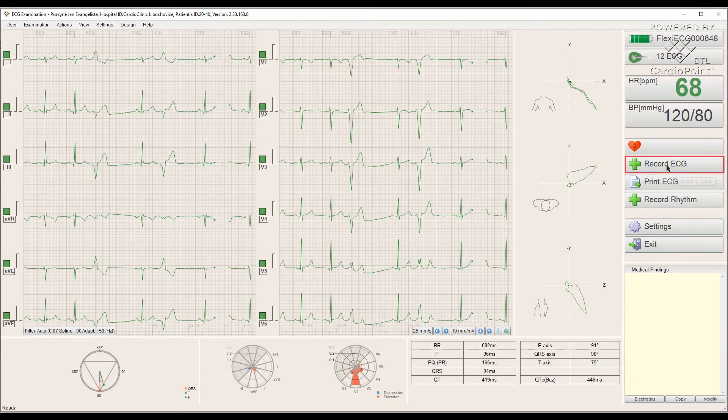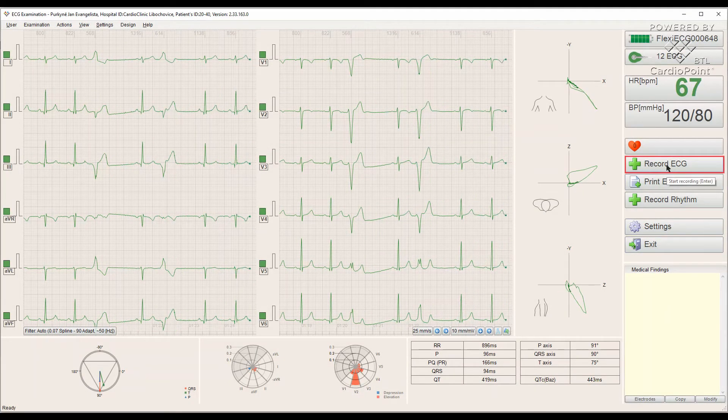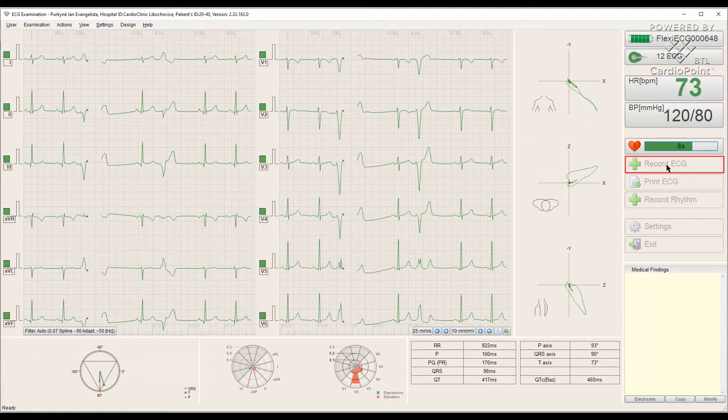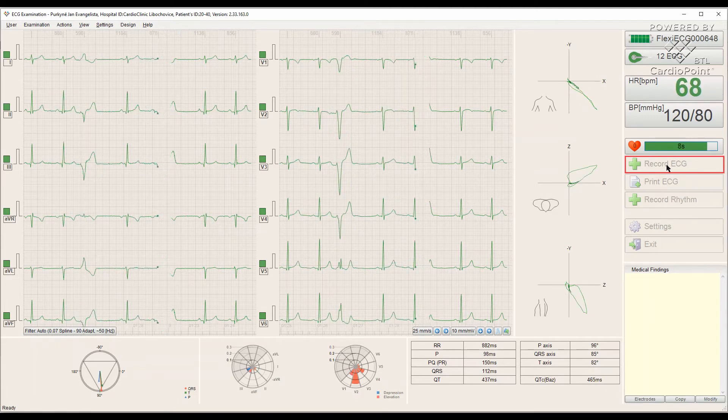In our case, we only need to record 10 seconds ECG, so let's click on Record ECG.